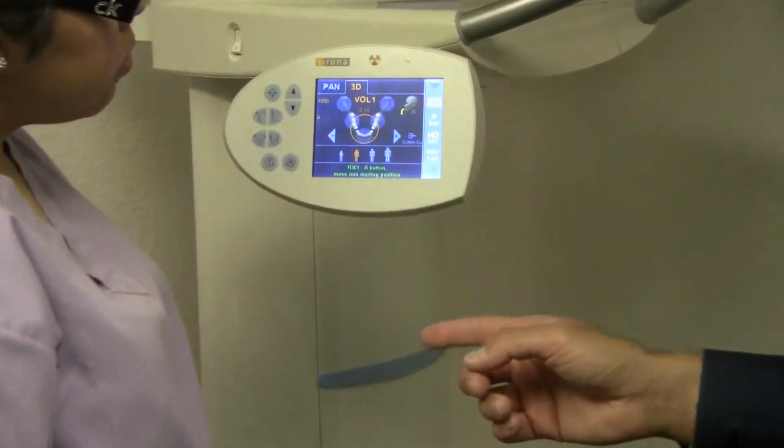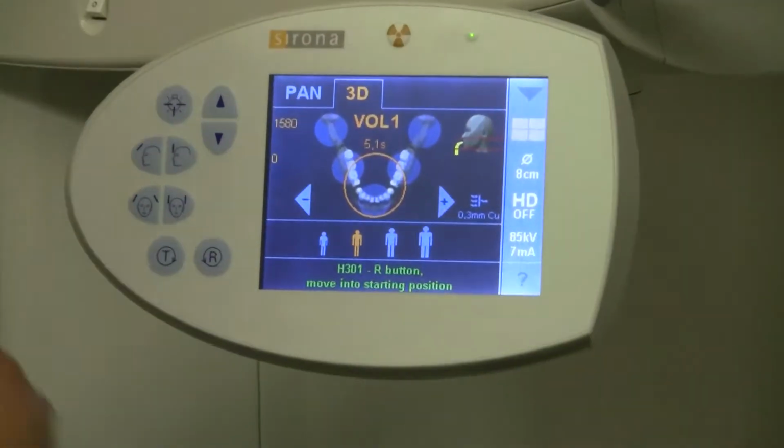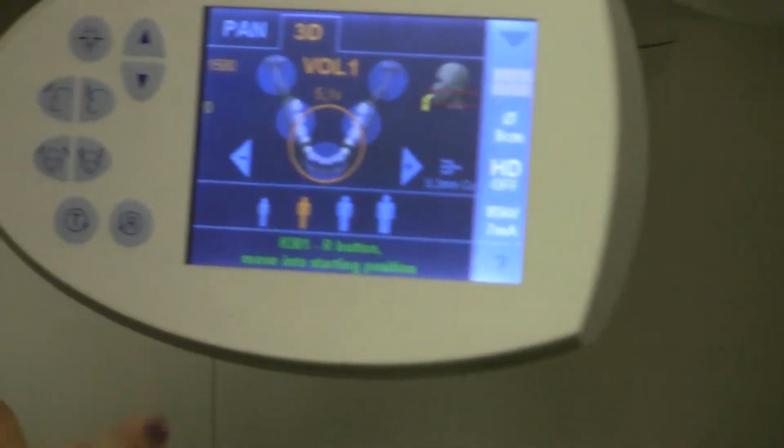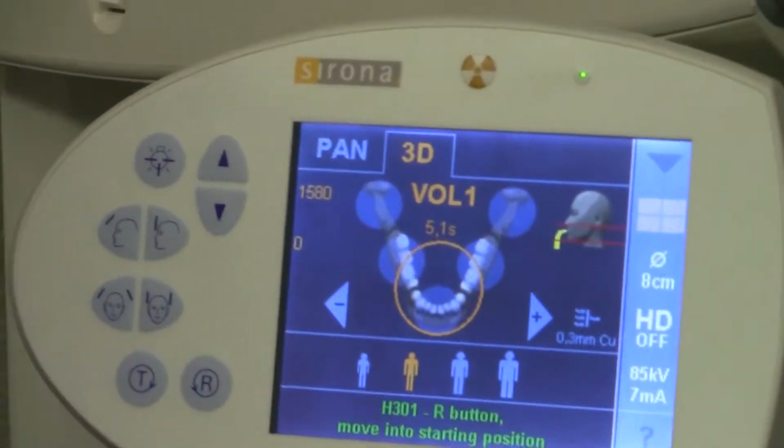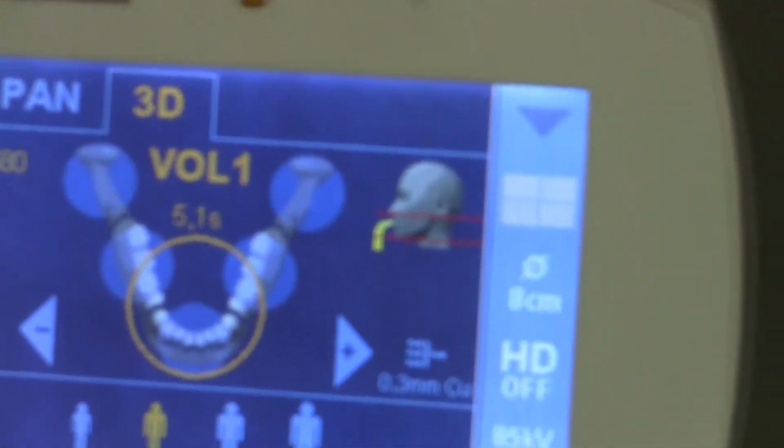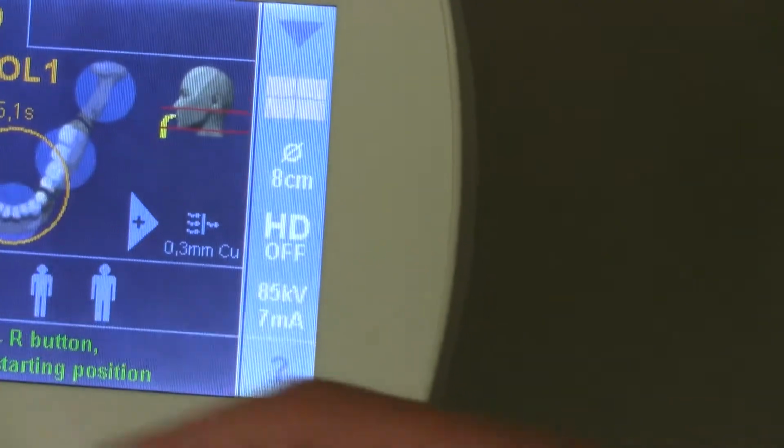Okay. Now, and that's only in the lower, right there. Upper and lower. Oh, upper and maxilla, lower and mandible. Yeah. Okay. So now, this doesn't mean that it's just the lower, no, this means in the anterior. See, think of it this way.